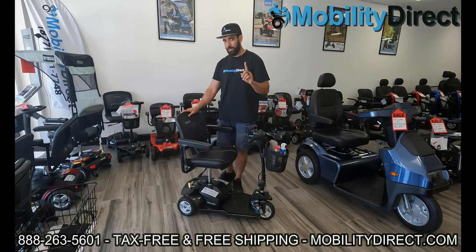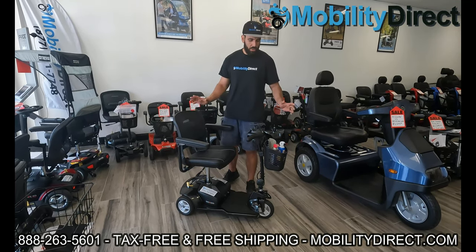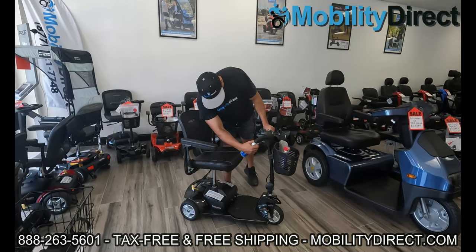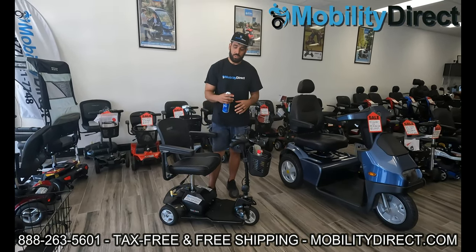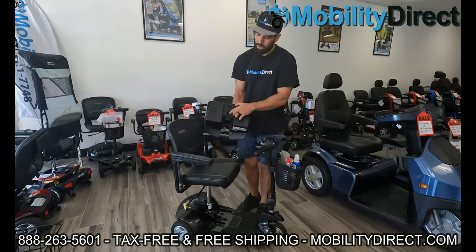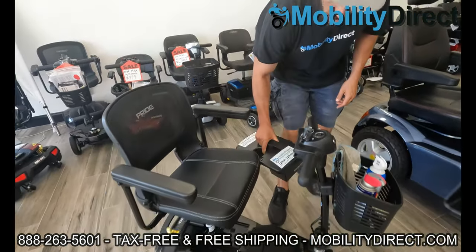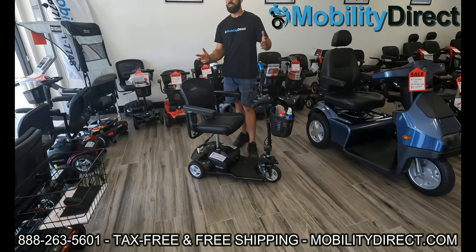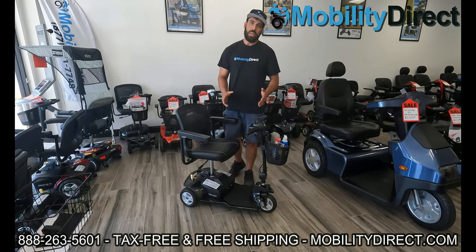Tip number one — probably the most beneficial — is to keep your scooter clean. If you have a can of compressed air spray, you can use it to get into your charging ports, get into where the bearings are on your wheels, and get into any part that opens and closes with electrical connections. The battery box comes right out and underneath you'll have connectors used to send power from the battery box to the scooter's electrical components — the controller, the wire harness — and you want to keep those connections nice and clean. The last thing you want is dirt, grime, debris, or grease building up in your bearings, electrical connections, or charging port.